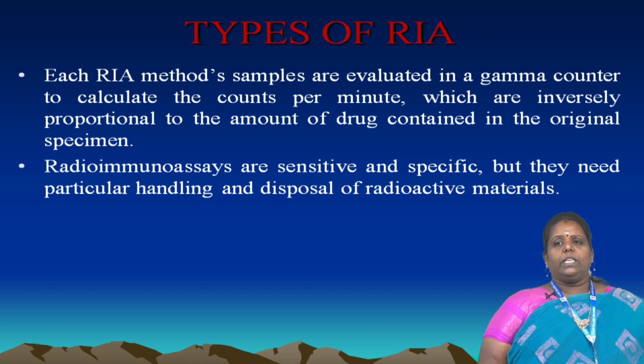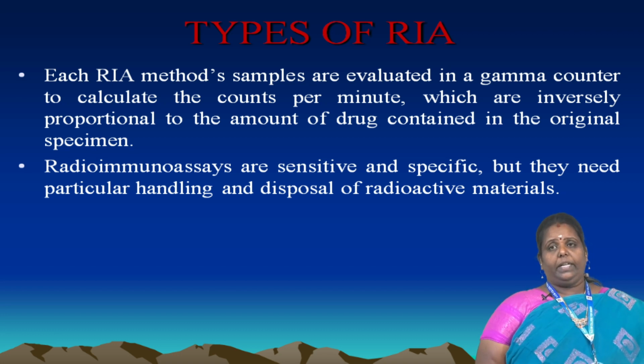Radioimmunoassays are sensitive and specific, but they need particular handling and disposal of the radioactive material. This radioimmunoassay method is important for identification by using radioactive material.